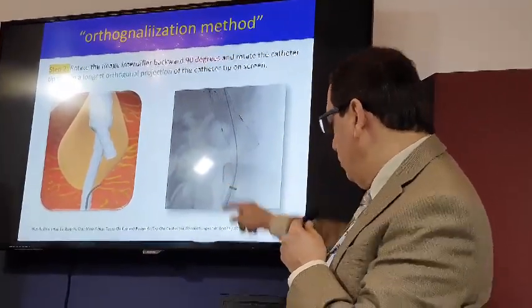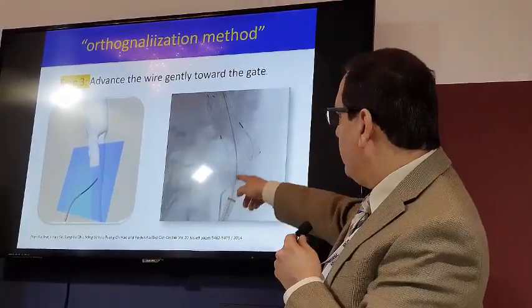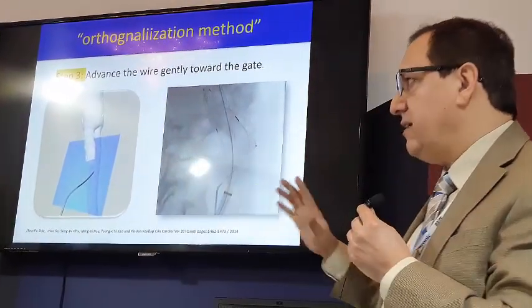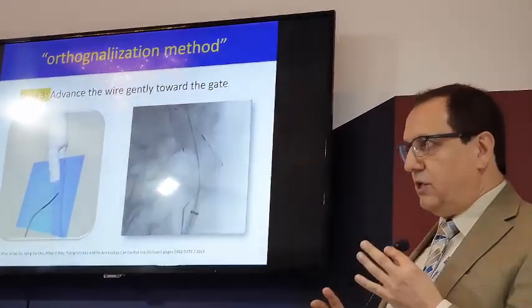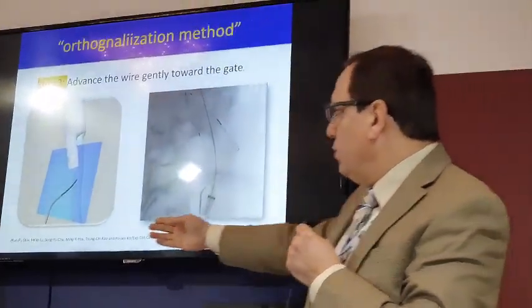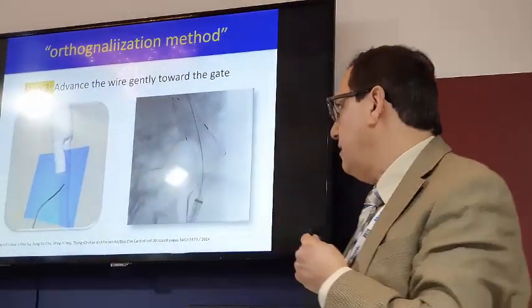And then, after you do that, you can see it here, and then you push your wire and it will go directly to that because you'll be in the same plane. Because remember, you are dealing with a 3D position, and you are in the cath lab only with 2D. So this way your catheters and the gate will be in the same plane by doing this technique.